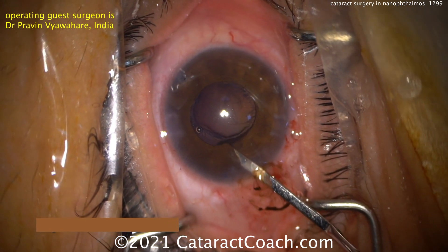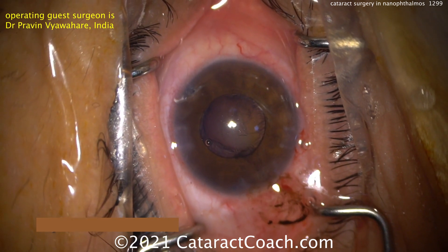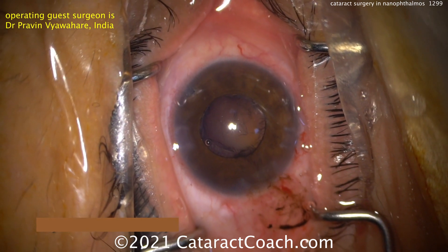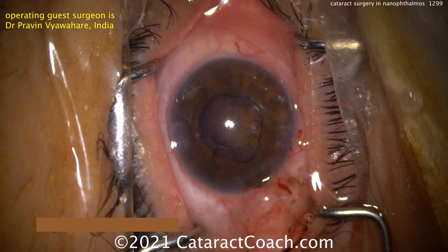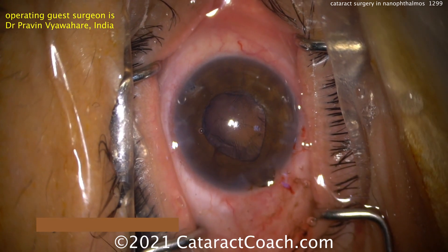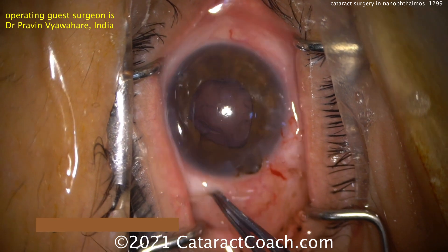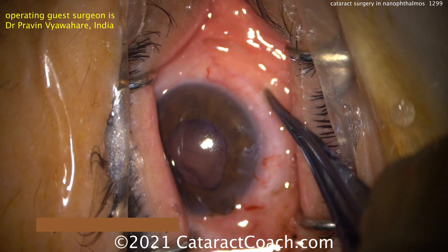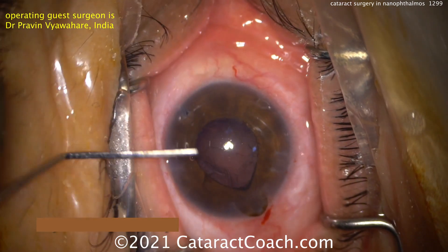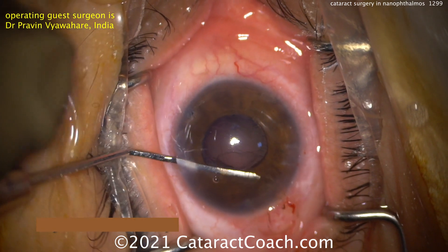The iris is prolapsing because there's obviously a little bit of a pressure gradient. You can try to release some of that pressure and get the viscoelastic out. I think a bimanual cortex removal will be the easiest — bimanual IA. That iris may continue to prolapse, and that's just the nature of these cases. You've got to set reasonable expectations for the patient. He's checking: is the eye too firm? Is there a choroidal effusion or choroidal hemorrhage? Luckily not — but that's an important check. 15mm is a tiny eye.